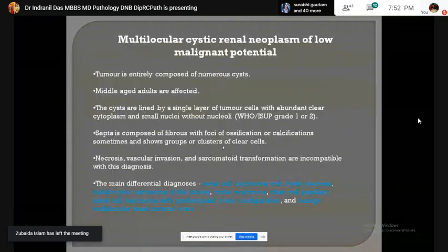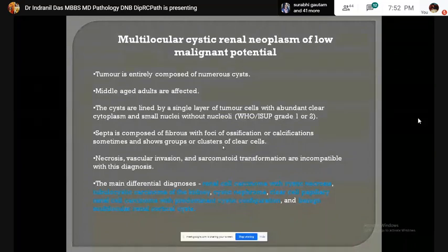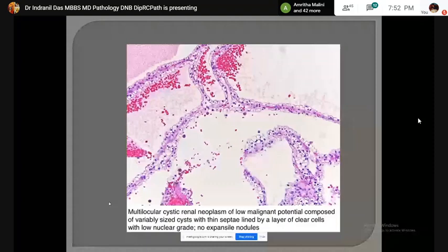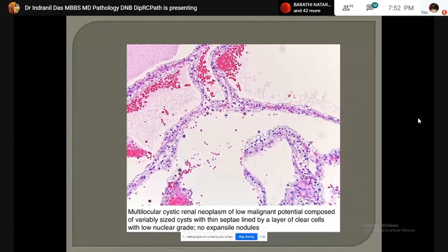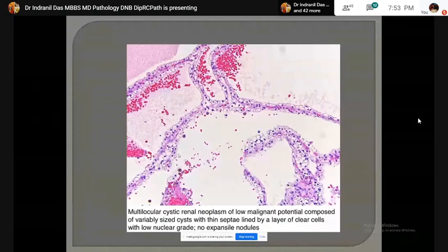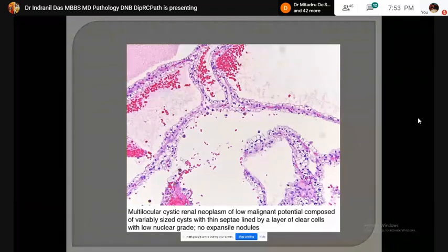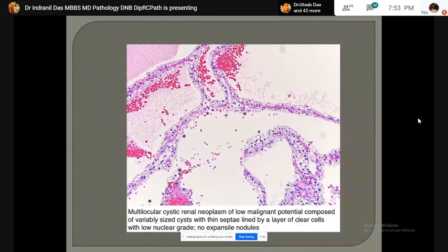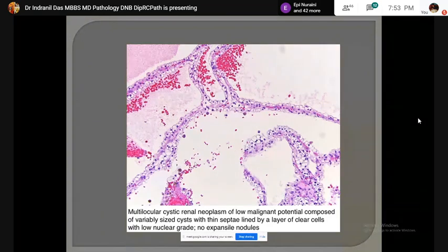Multilocular cystic renal neoplasm of low malignant potential: grossly, the tumor is entirely composed of cysts, and middle-aged adults are affected. The cysts are lined by a single layer of cuboidal cells with abundant clear cytoplasm, and nuclei are of low grade, similar to ISUP/WHO grade 1 or 2. Groups or clusters of clear cells with similar morphology are seen within the cyst walls. Necrosis, vascular invasion, and sarcomatoid transformation are incompatible with this diagnosis.